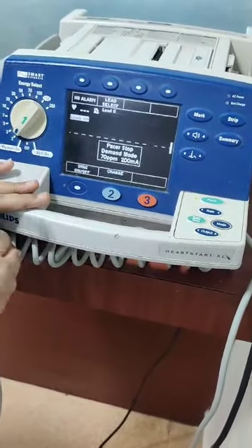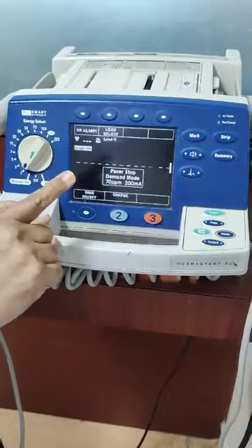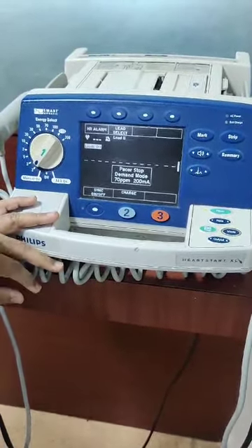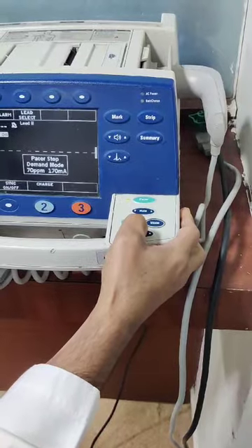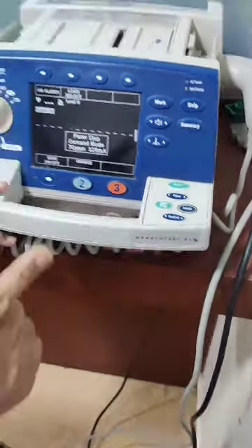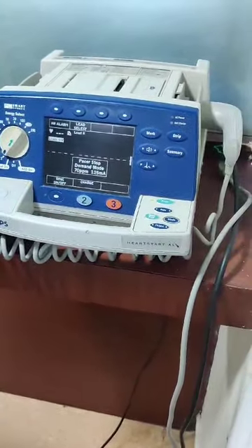I'll confirm with the help of seeing the traces and pulse of my patient and blood pressures. So then I'll reduce this output like this. I'll reduce it, and my machine will give as per demand of the patient, as per requirement of the patient.